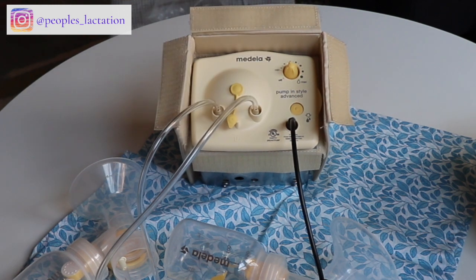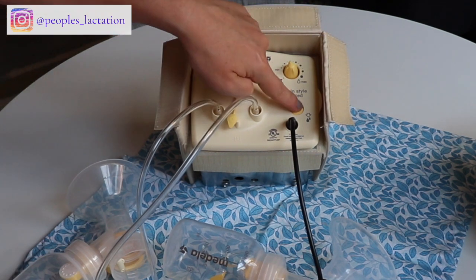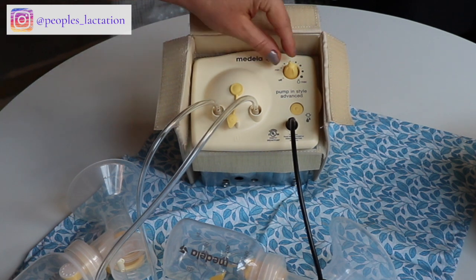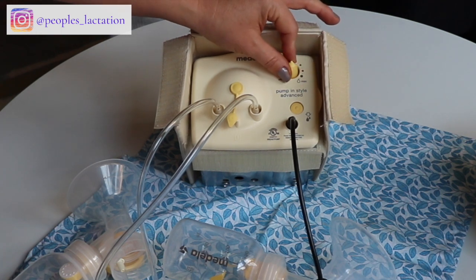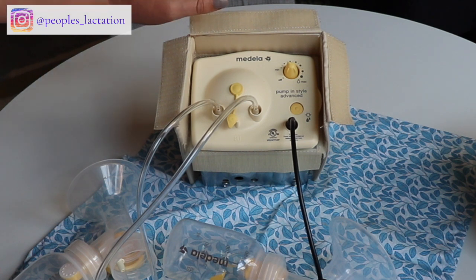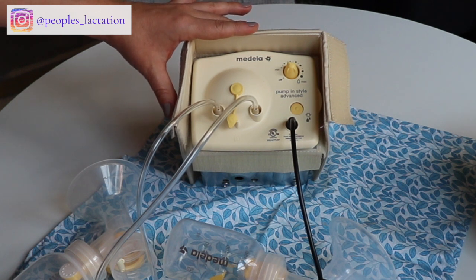That will initiate another letdown phase, and once the milk starts to flow faster you can hit that button again to go back into expression phase. In the expression phase you can adjust the strength and suction using this knob — it does get pretty strong and noisy, so only adjust to your comfort. You don't want to cause pain while pumping, so if pumping is hurting, turn down the suction.